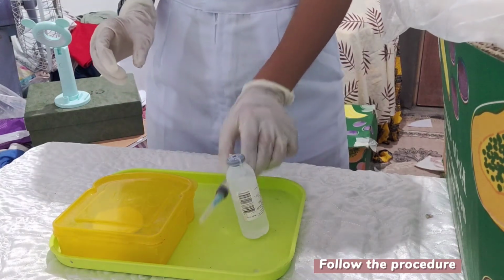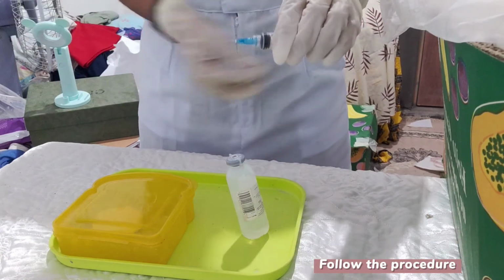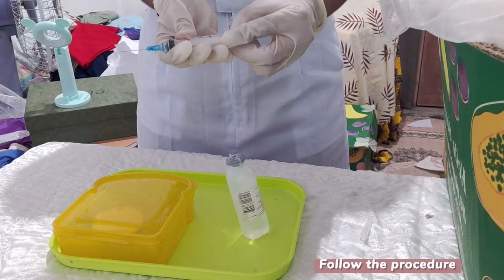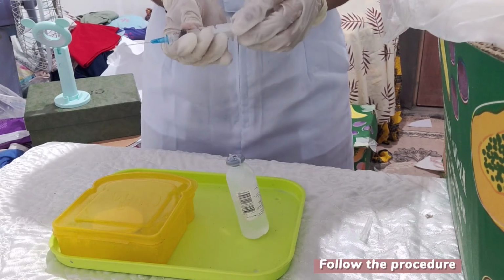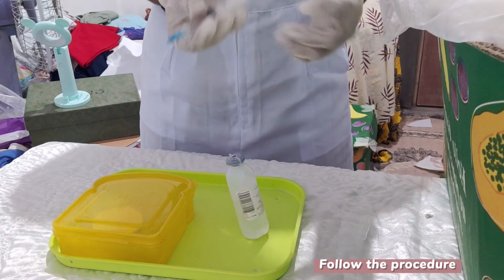Now we will get the syringe and pull straight the cap of the needle. Before we aspirate the medication, we need to first aspirate an equal amount of air into the syringe.